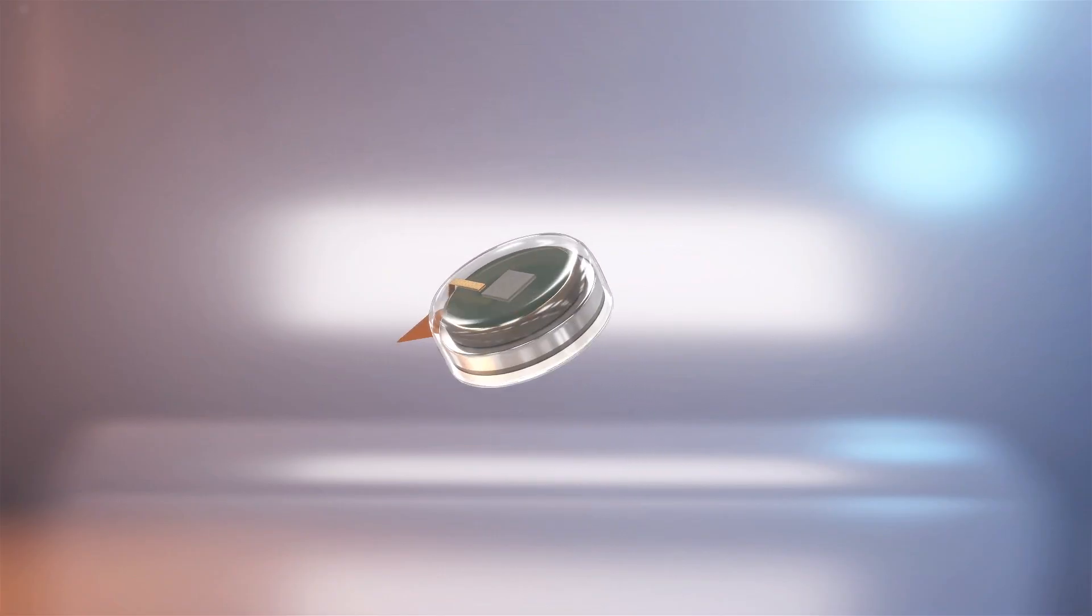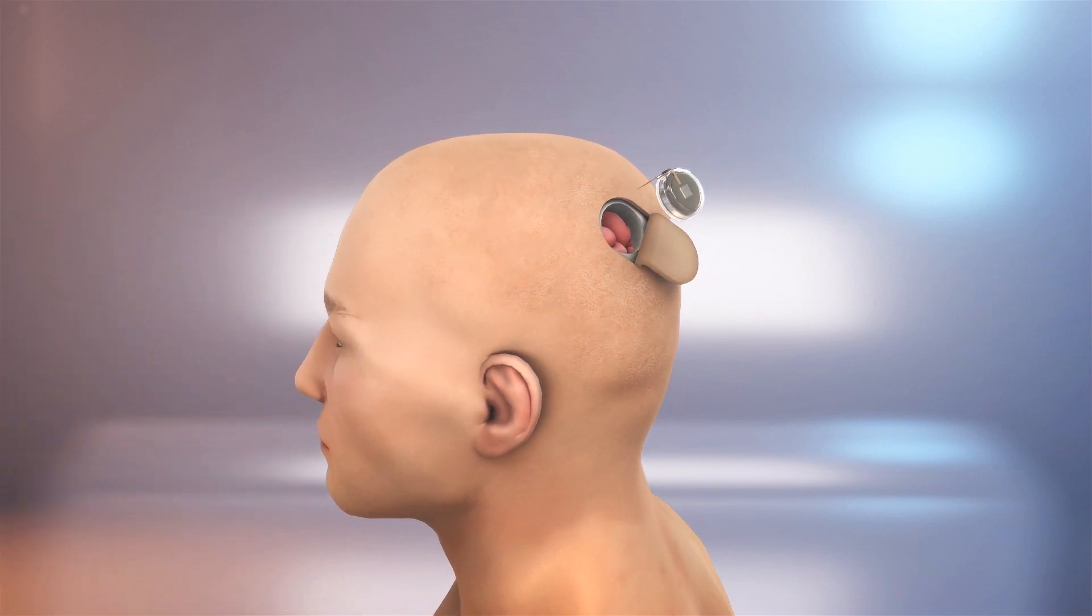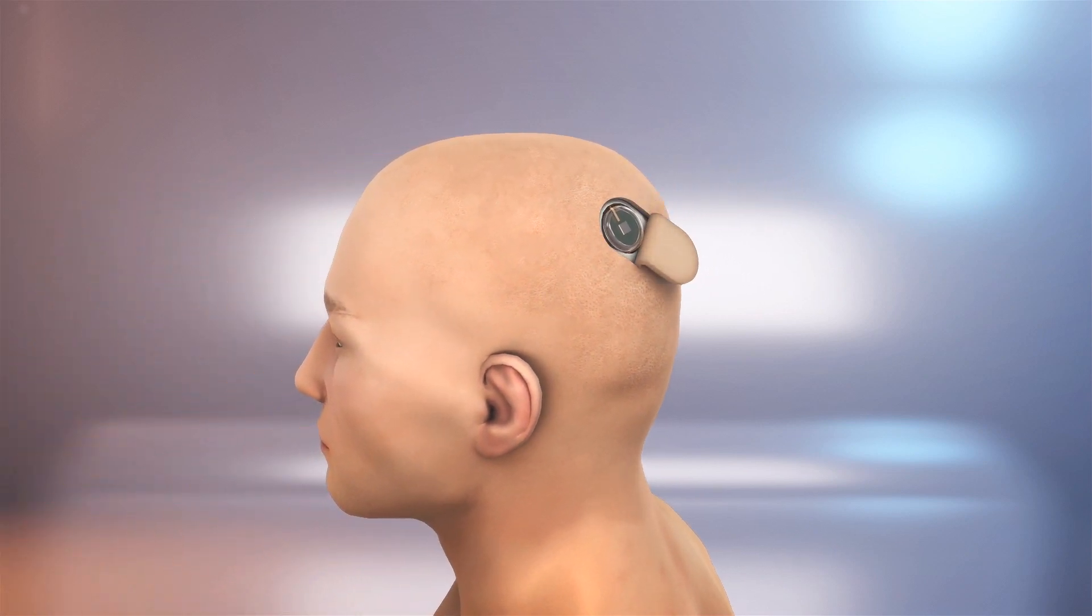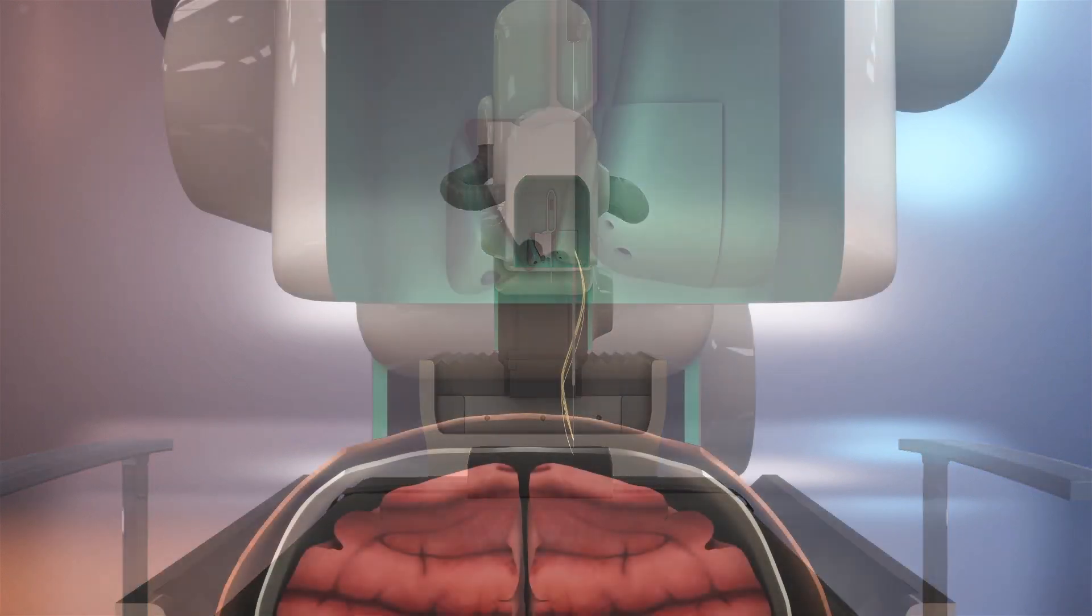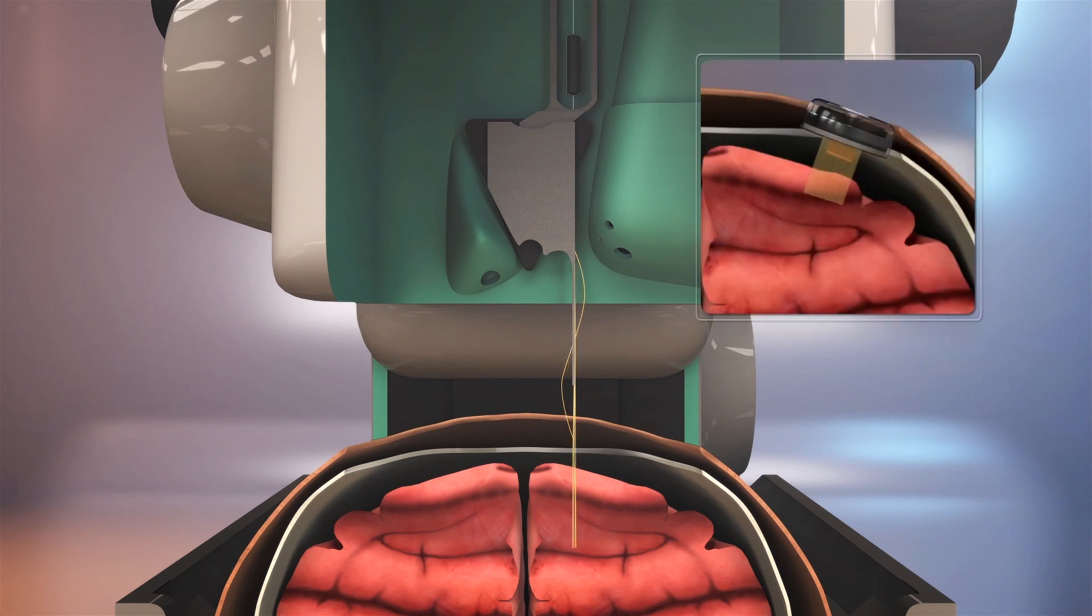In a presentation posted to Neuralink's YouTube channel, Musk says the implant is 23mm by 8mm and has electrode threads that attach to it that are implanted into the brain. The implant is inserted by removing a piece of skull. It then sits flush with the skull, unnoticeable to others beneath hair.